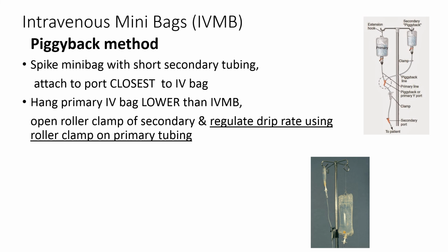One thing to remember though, when you're mixing any type of IV fluid using this piggyback method, we want to make sure we look at compatibility. Compatibility means: are these fluids able to be mixed together? You need to make sure that IVs are compatible before we administer them in the same line, because if not, we can get crystallization in that line and problems with that medication upon administration if we do not check compatibility.